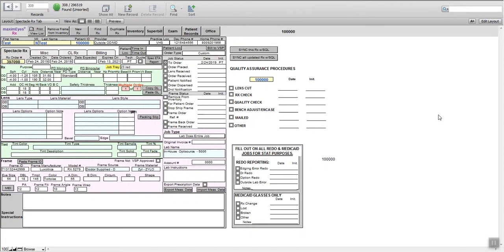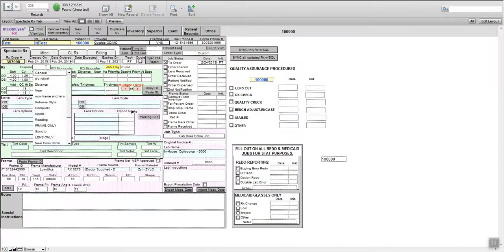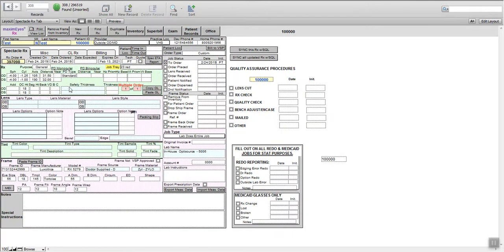Now we're going to do a single-vision poly private pay. This patient has a very thick prescription. The doctor has sent over this prescription for us. We've measured our PDs and optical centers with the frame, but now we want to choose a nice thin lens.